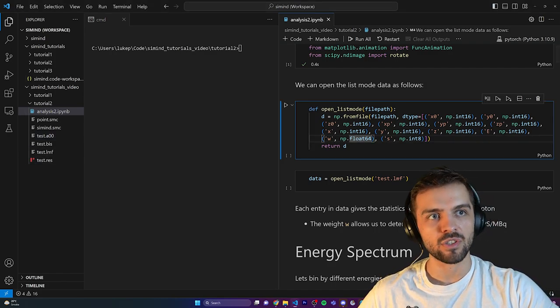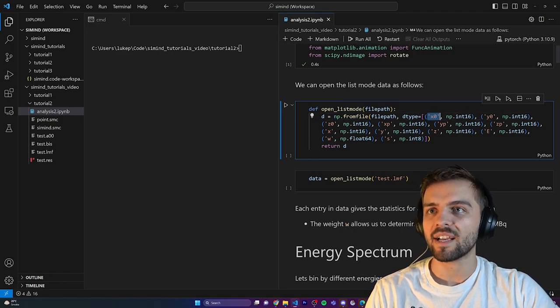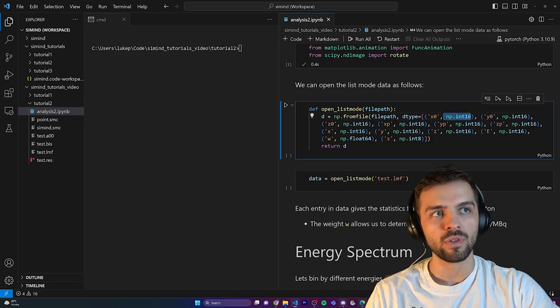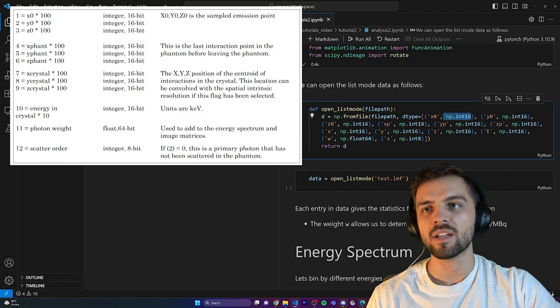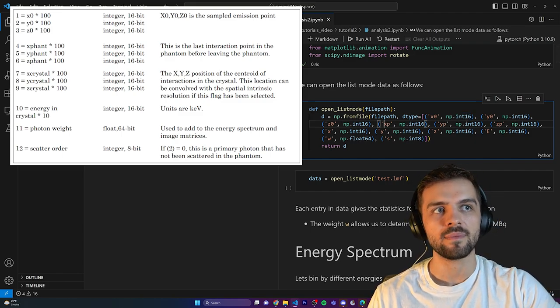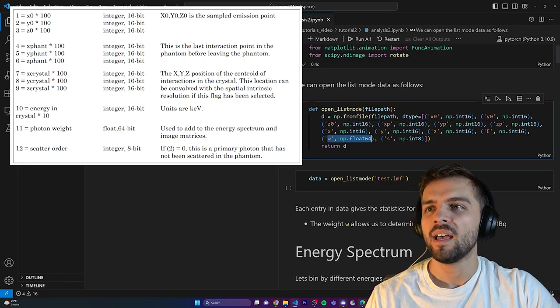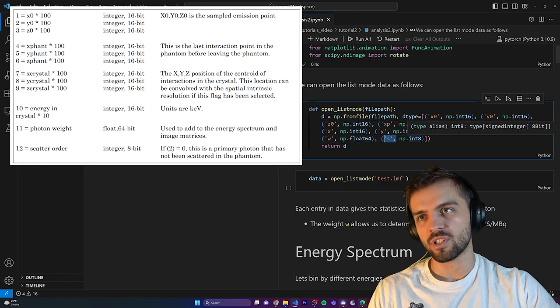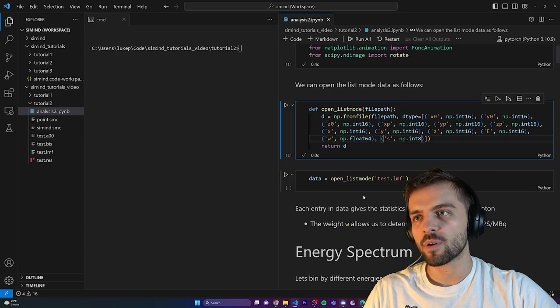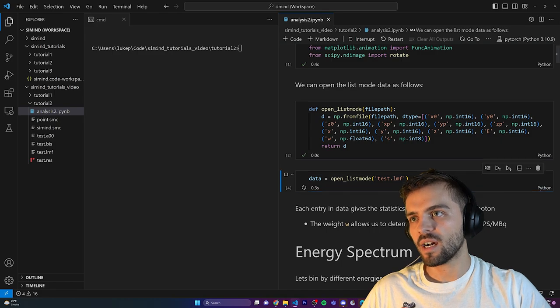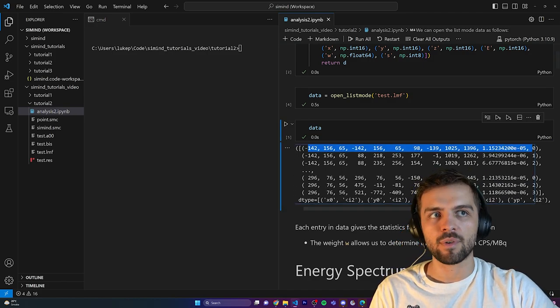So we have this .lmf file with 12 different data fields. It uses the fromfile format because it's a binary format. X0 is a 16-bit integer — I know that from the data file shown on screen. The first coordinates are X, stored as 16-bit integers. Then there's the last position in the phantom, also 16-bit integers. The weight is stored as a 64-bit float — a pretty big data type. The scatter order is stored as an 8-bit integer, usually 0, 1, 2, or 3. Opening with the open_list_mode function gives a NumPy array where each row corresponds to a photon with all listed parameters.